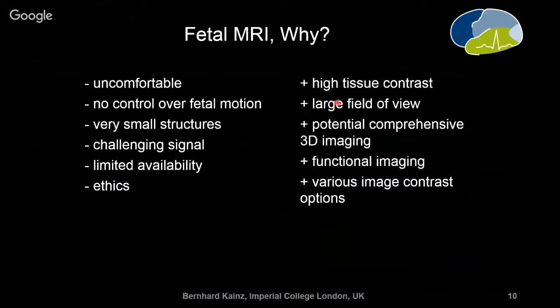And we have the option for comprehensive 3D imaging. This is the challenging part, so this is what we are actually working on. But there is the opportunity to image the whole fetus at once in a 3D volume, which has, of course, distinct advantages over single slices in ultrasound, or even 3D ultrasound, which has only a small field of view.